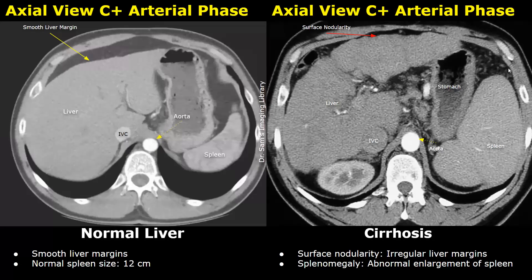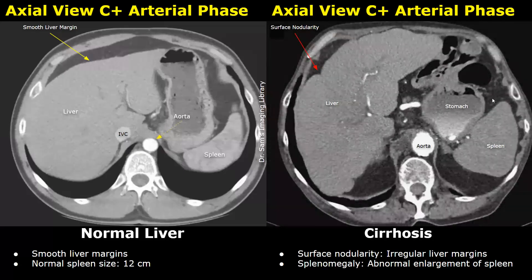Splenomegaly is also present in that case. This is another case of cirrhosis — these are contrast-enhanced images in the arterial phase. Irregular liver margins are seen. The spleen is not fully seen in this image, but splenomegaly was present.